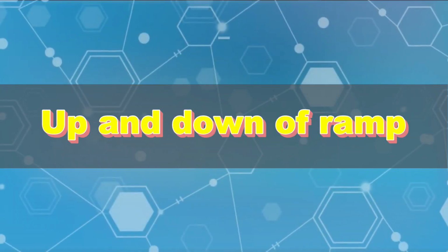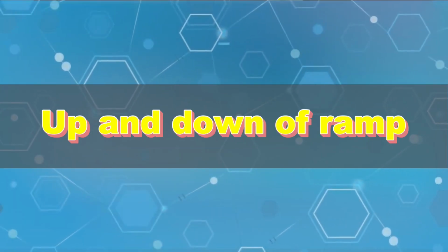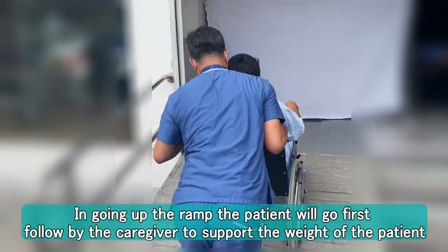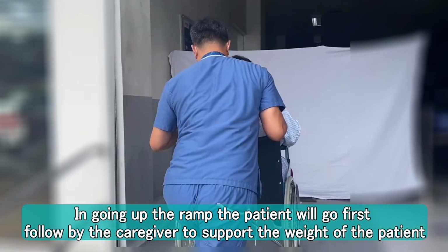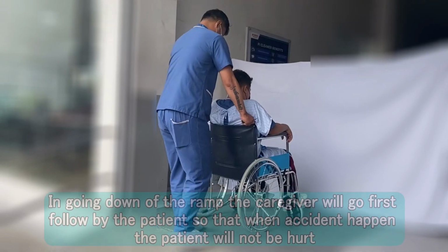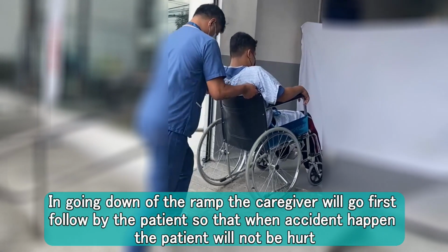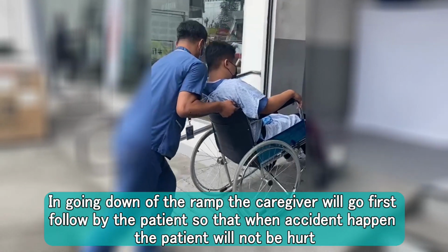Up and down the ramp. In going up the ramp, the patient will go first, followed by the caregiver to support the weight of the patient. In going down the ramp, the caregiver will go first, followed by the patient, so that when an accident happens, the patient will not be hurt.